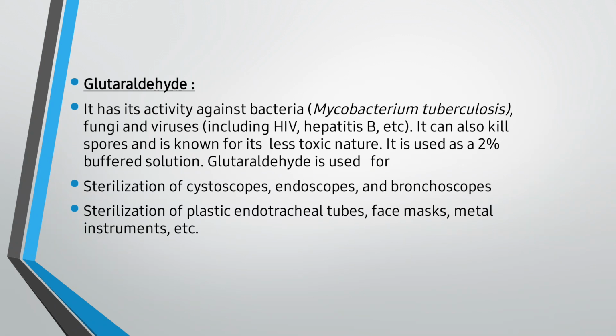Glutaraldehyde. It has activity against bacteria, Mycobacterium tuberculosis, fungi and viruses. It also kills spores and it is less toxic in nature. It is used as a 2% buffered solution. Glutaraldehyde is used for sterilization of cystoscopes, endoscopes and bronchoscopes.